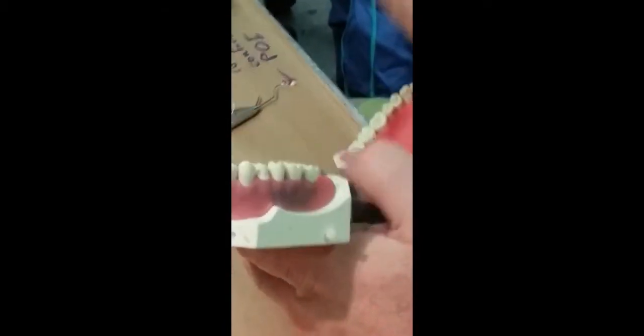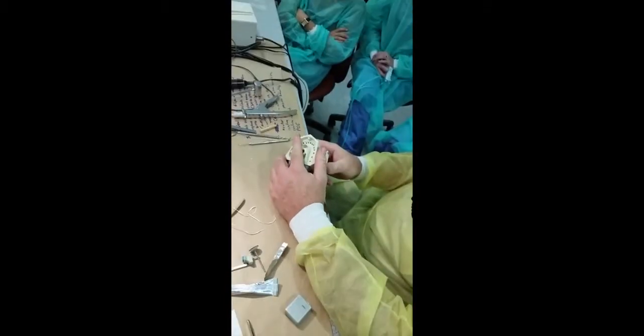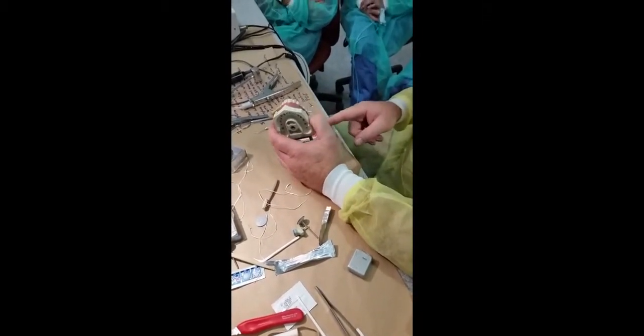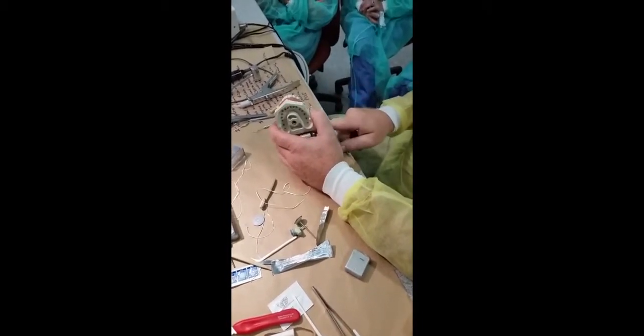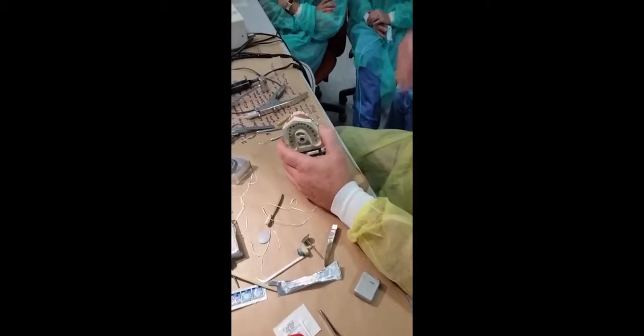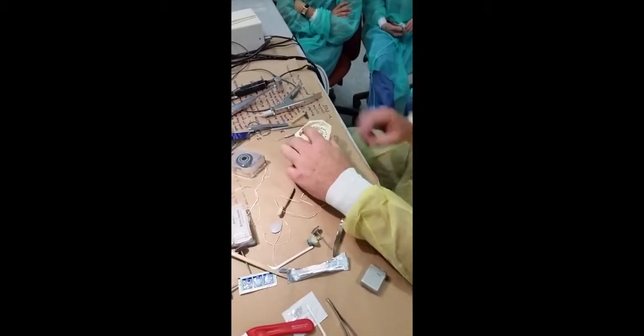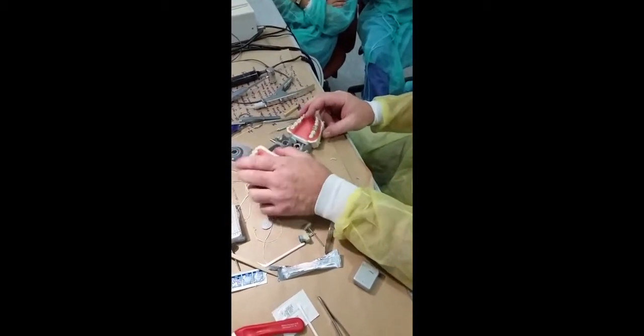You wouldn't panic and say we're going to cut it off and start over. The other thing I was doing was sealing the proximal and making sure it's good and smooth. You should have the patient bite back down and check with the Mylar. We've added cement, so it might not seem the same as before. If the bite feels high and the contact is tight here and loose here, we could be shifting tooth 31 distally — what they're feeling is hyperocclusion on the mesial of 31. So I'd probably be very shy about adjusting occlusion for the first couple of days. Make sure they come back and check it later — it's not common, but it does happen.